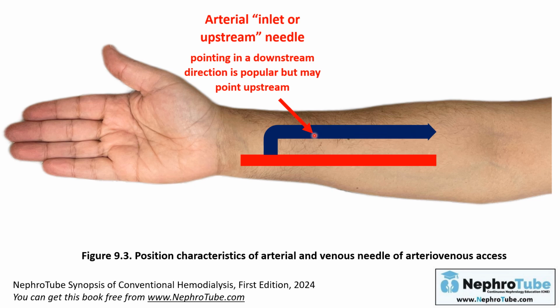This is the most popular cannulation direction, but actually it can be used also pointing upstream, but pointing downstream is more popular.